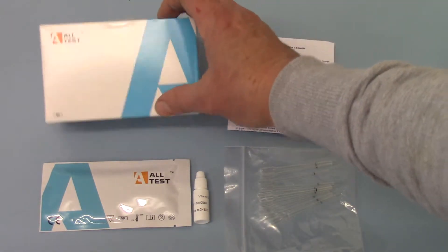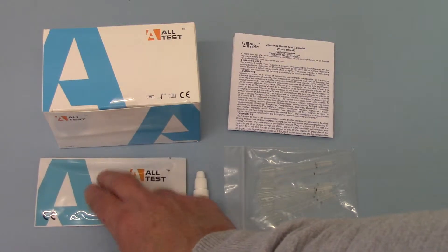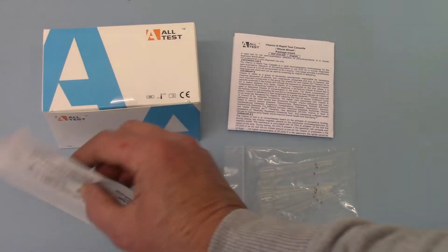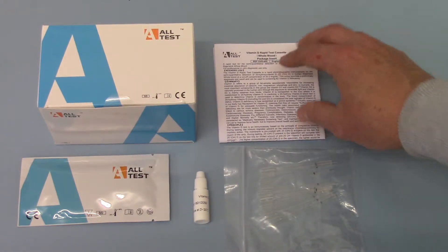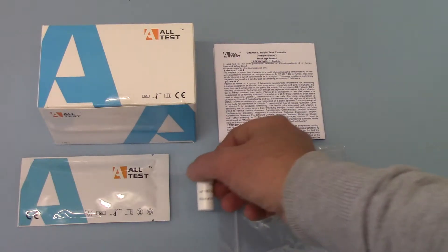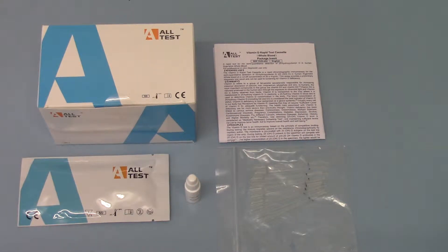Here we have the pack showing the test cassette, individually foil wrapped. The expiry dates on these are currently running at 2020-01. You've got the capillary droppers for transferring your blood sample, and if you're using whole blood, serum or plasma, then you've got your buffer solution there as well.